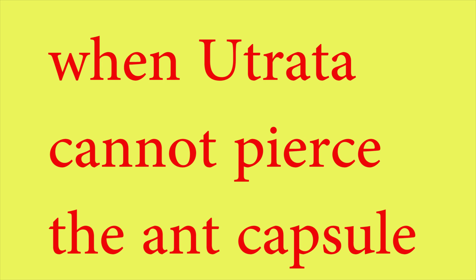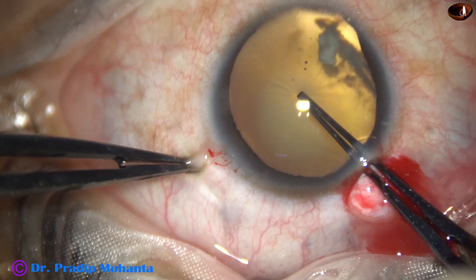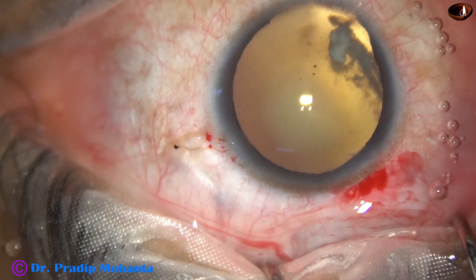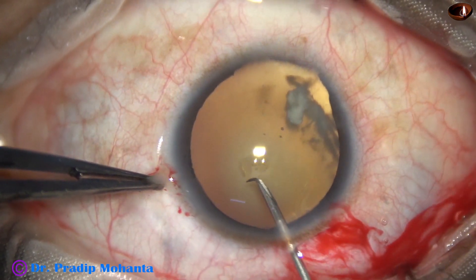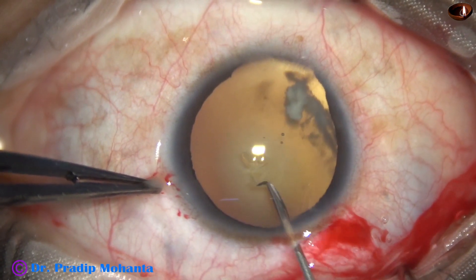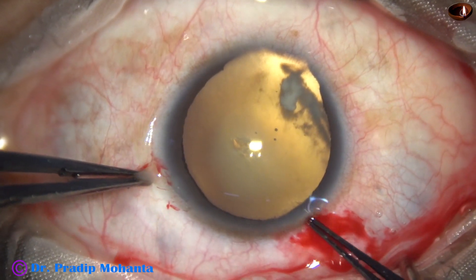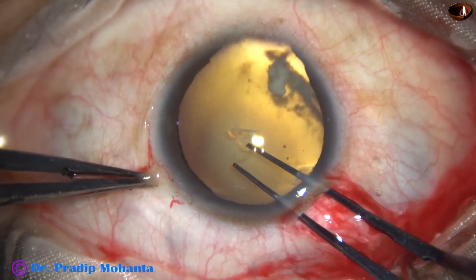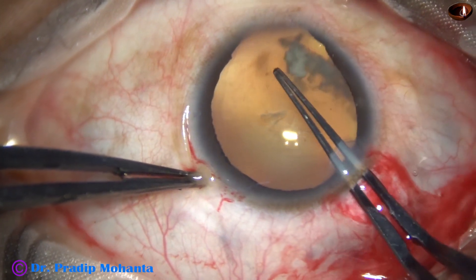Now, when utrata cannot pierce the anterior capsule, what to do? In this case there is zonular weakness and the utrata cannot pierce the anterior capsule — there is wrinkling of the anterior capsule as we try to pierce it. In this case, a sharp needle helps. With a sharp needle we can easily cut the anterior capsule and raise a capsular tag. And now we hold this capsular tag and go anticlockwise.